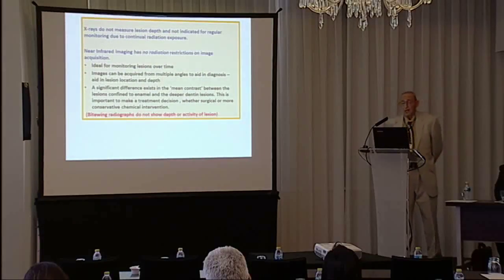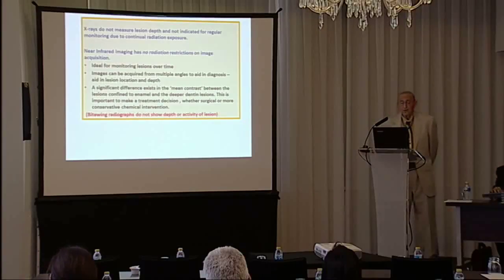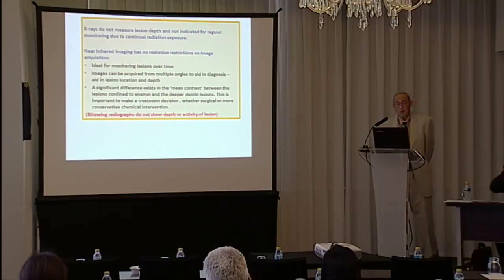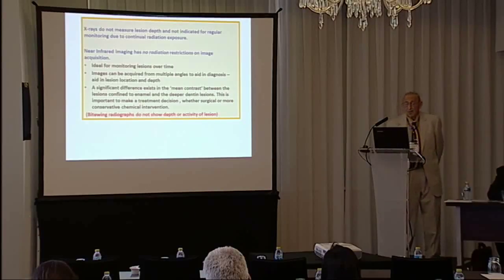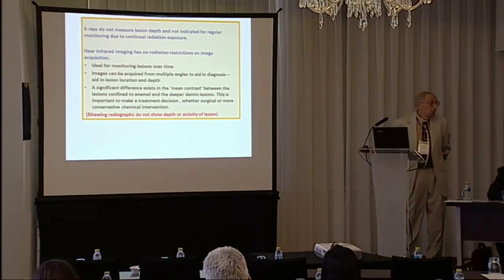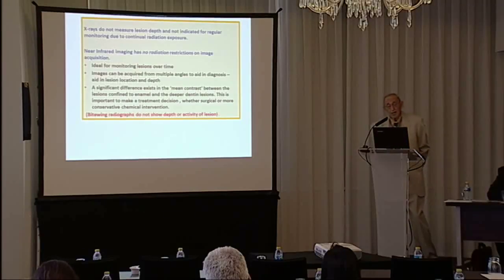X-rays do not measure lesion depth and are not indicated for regular monitoring due to continual radiation exposure. Near-infrared imaging has no radiation restrictions on image acquisition. It's ideal for monitoring lesions over time. Images can be acquired from multiple angles to aid in lesion location and depth.